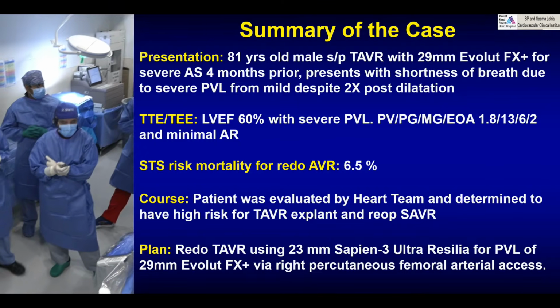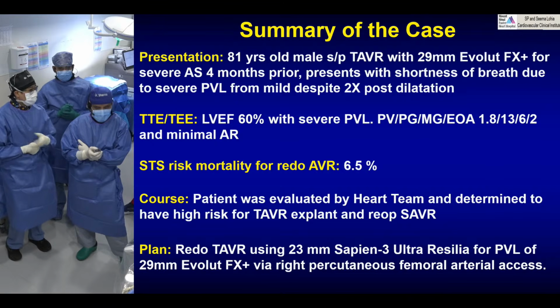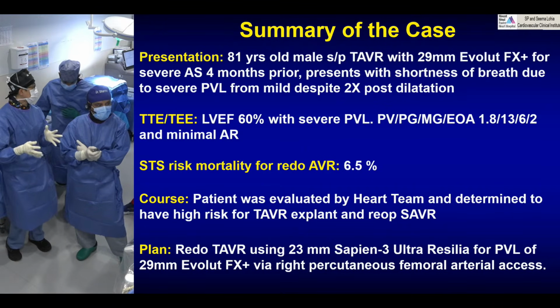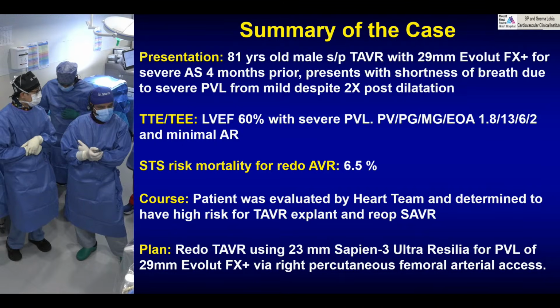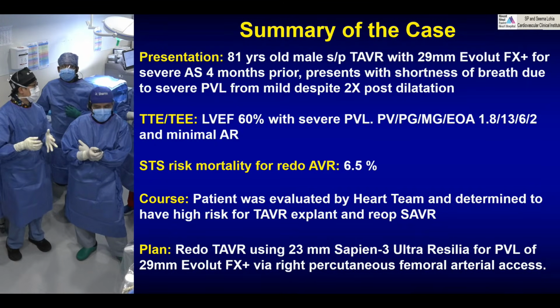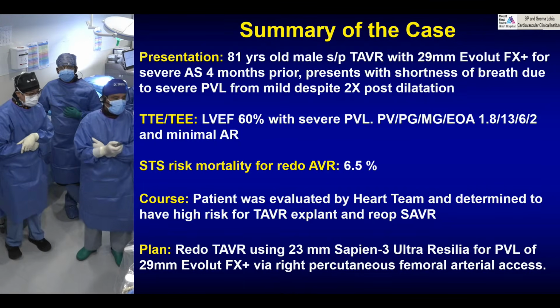There is a trade-off, like you said, even with the index TAVR, self-expanding versus balloon expandable. This is also going to be a potential trade-off between two different sizes. A larger size will get better radial force and seal, but does run the risk of potential injury. A smaller size you might not seal, but you'll be safer. But here we have to seal it.